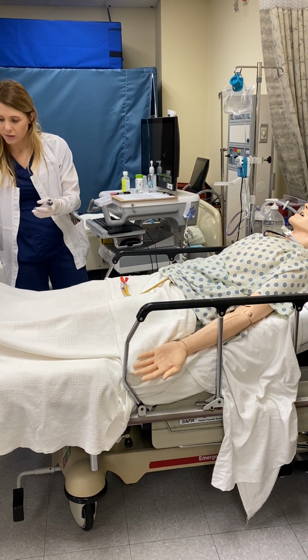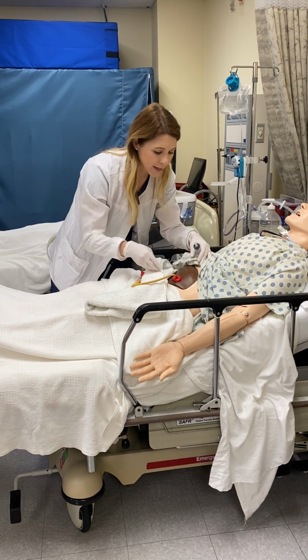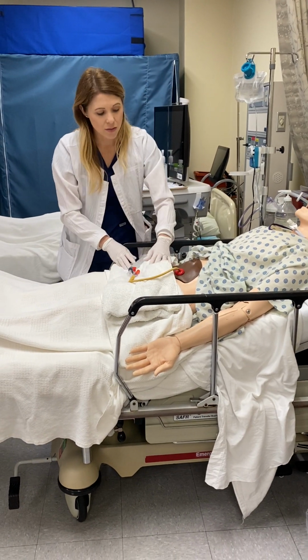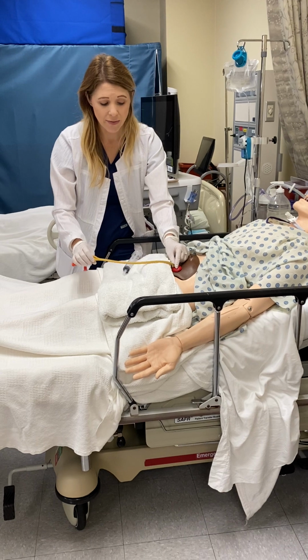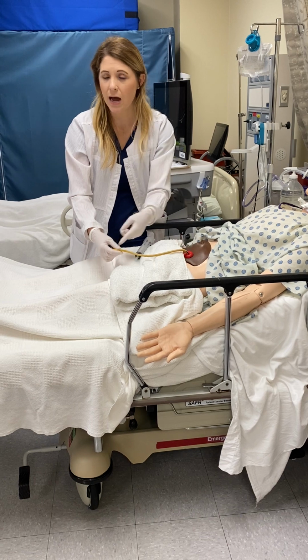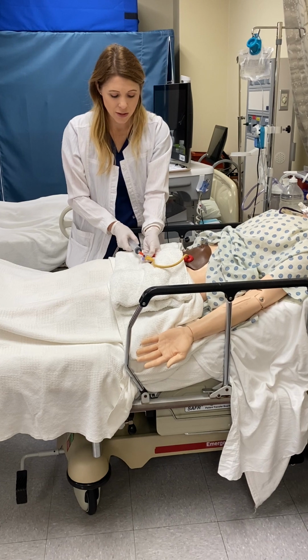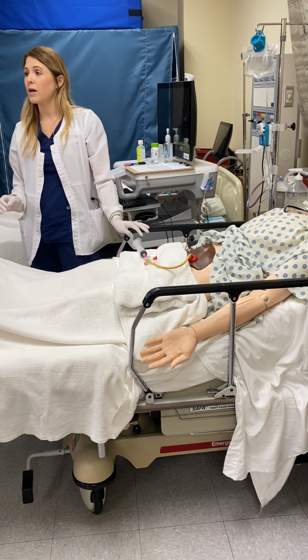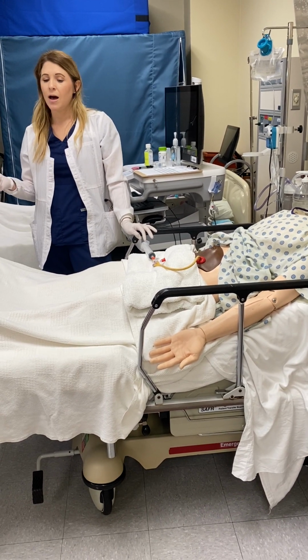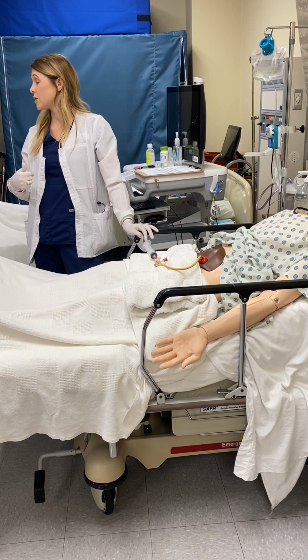So the first thing I have to do is place my towel under here in case we have any seepage. I'm going to look at your site to make sure it looks clean around the PEG tube. I'm also going to identify by the chart, okay, we should be at a 19 or whatever measurement the doctor said, how long it hangs out, so to speak. And the last thing I have to do, since a patient is getting a continuous feeding, is check a number called a residual. Sometimes people who have feedings are not going to digest it immediately, right? So they might still have a little feeding in their stomach.